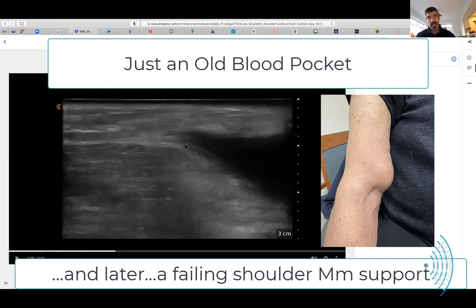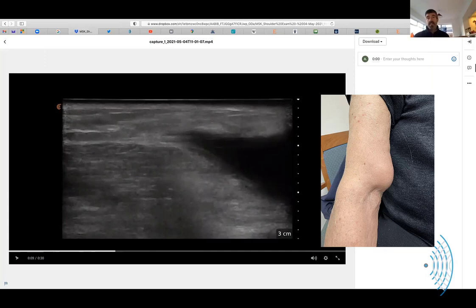Okay. Yeah, which means that it makes me think of fluid, essentially free fluid, but not in the tummy, in the area you're looking at. And so the options are relatively small for free fluid. You do get free fluid abscesses, but I don't think that's normally the process, and it doesn't look like this. You can get solid masses that could mimic it, but again, that's a bit esoteric. So we're looking at blood. And a typical reason for blood to occur in someone in the age group you're in at a non-standard area is blood thinners.